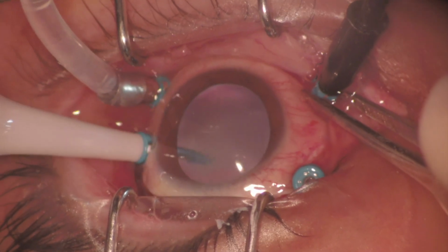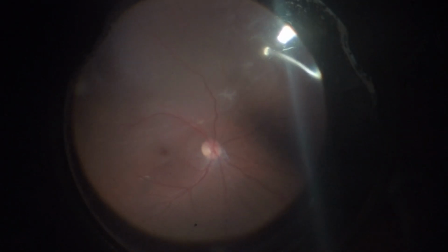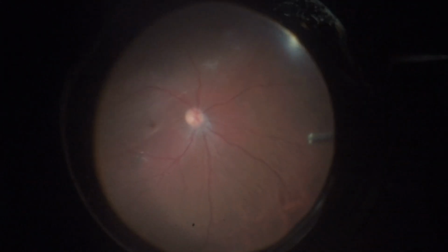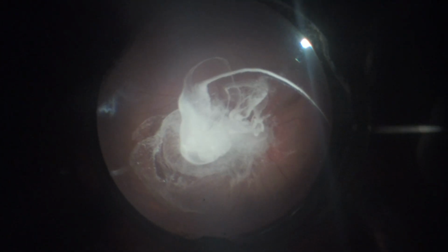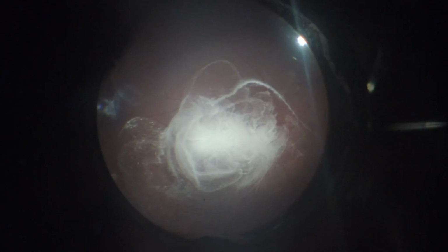A 25-gauge 4-port system with auxiliary illumination was employed to perform the pars plana vitrectomy in a young patient with a clear lens. Note that he presented with a macula-off retinal detachment, showing signs of chronicity in the inferior periphery. A major challenge in this type of surgery is inducing PVD.